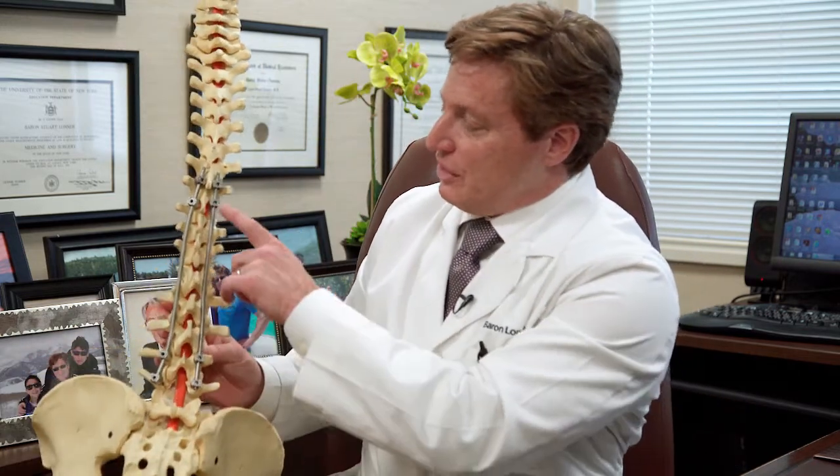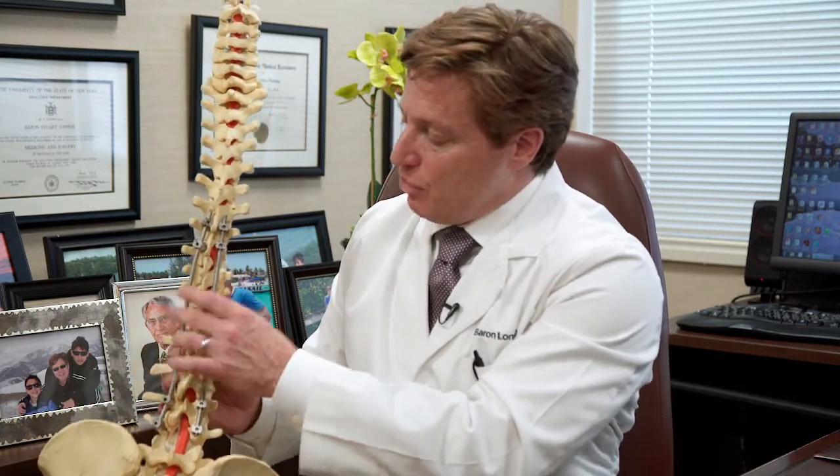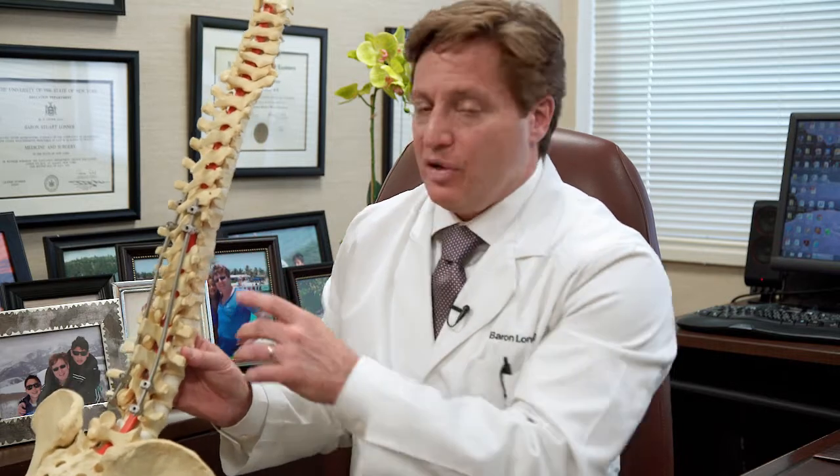What you may have heard, or for those who have not heard this discussion before, the standard of care for the treatment of severe scoliosis is a spinal fusion. And in the recent past, over the past 10 years or so, that has largely been done from a posterior or back approach. So we place rods and screws as shown here in this model. These aren't particularly expertly placed, but one of our reps placed it. But nevertheless, I think it shows you that these solid rods are placed and screws are placed into the vertebra and the spine is corrected, and that is a spinal fusion.